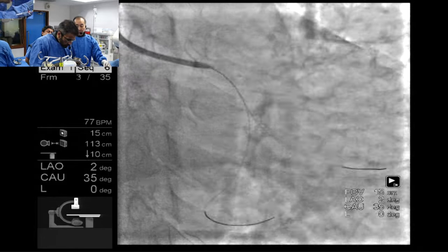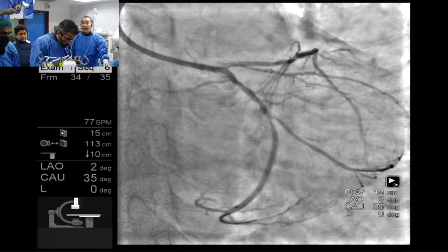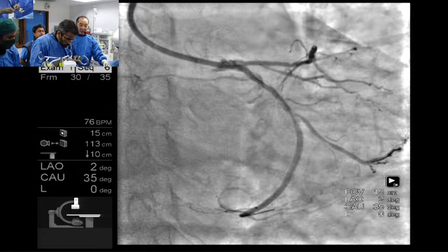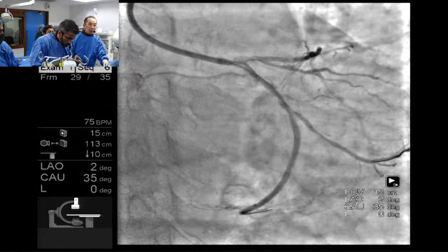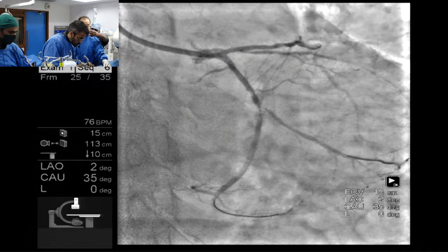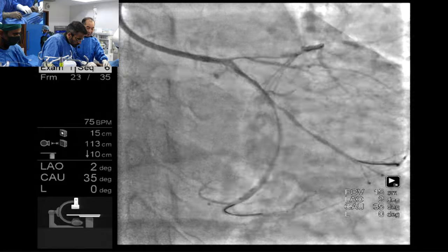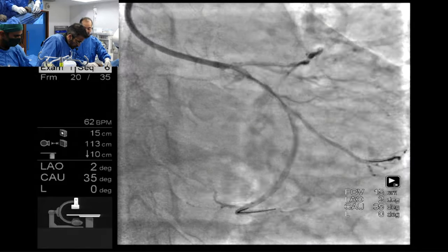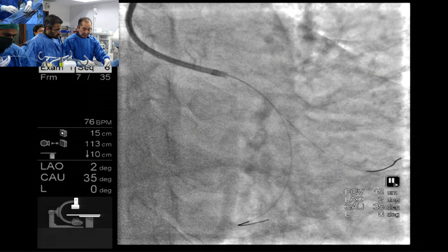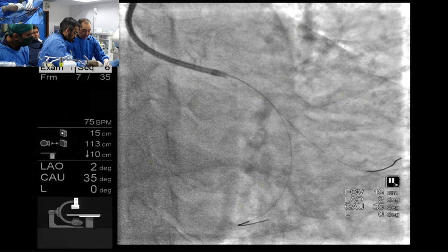Yes, absolutely. Length matters. Even angle has been shown by Dr. Ladislav Zavik and his group from Toronto to have some bearing on the angiographic outcomes, especially with the crush technique or the Culotte technique. The angle is very important. Now, the disease in the OM is very long. It extends for more than 20 millimeters, it looks like. So you are going to cover the whole thing, normal to normal.